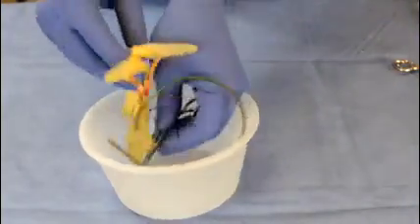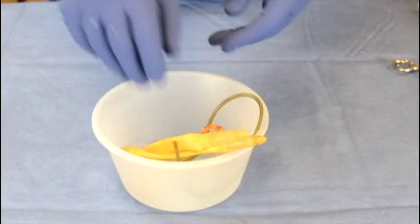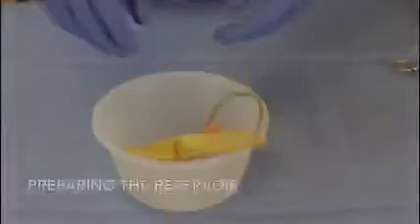For components treated with InhibiZone antibiotic surface treatment, place the prepared cylinders and pump onto an empty, non-covered sterile tray, empty kidney basin, or sterile Mayo stand. Components should not be submerged in saline. Soaking antibiotic-impregnated devices in saline will cause the antibiotics to diffuse off the device into the solution. This will cause the solution to turn orange.